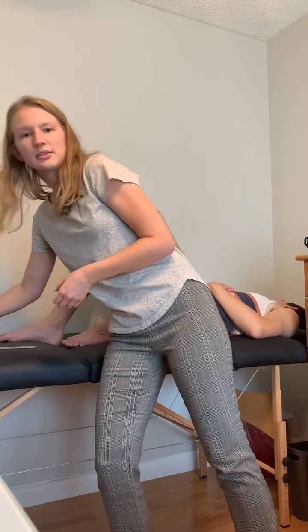For every joint, there are normal ranges that everybody should be within. As far as knee flexion, the normative range would be between 130 and 140 degrees. So he's right on the higher end of the normal range. If he were to be below normal, that would be considered limited or hypomobile. As far as being over normal, that would be considered hypermobile.